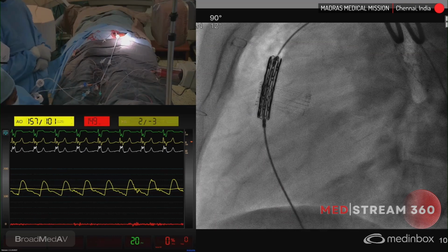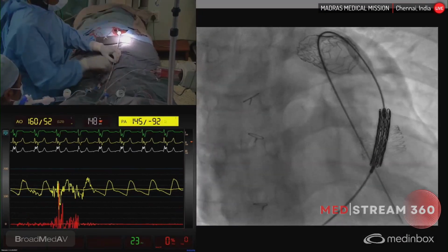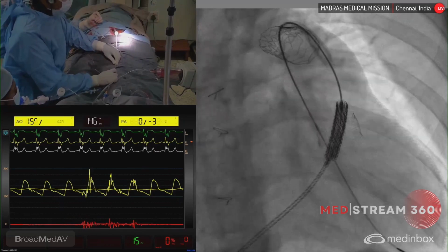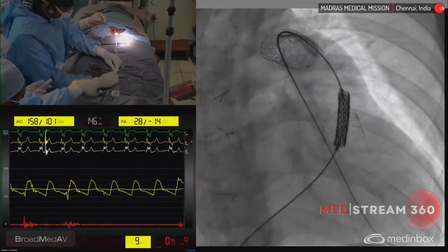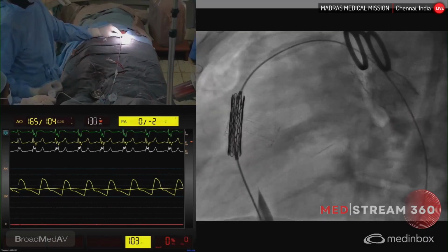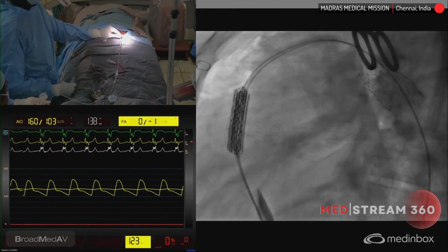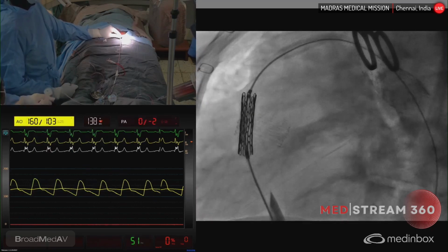Now let us come to AP itself. Make the stent come in profile. So now I am exposing the sleeve of the melody valve. So now I have got the sleeve out totally. We can inflate the inner balloon. The inner balloon's burst pressure is around 4 atmospheres. Yeah, so let us go to 4.5. Okay, I'm inflating now.